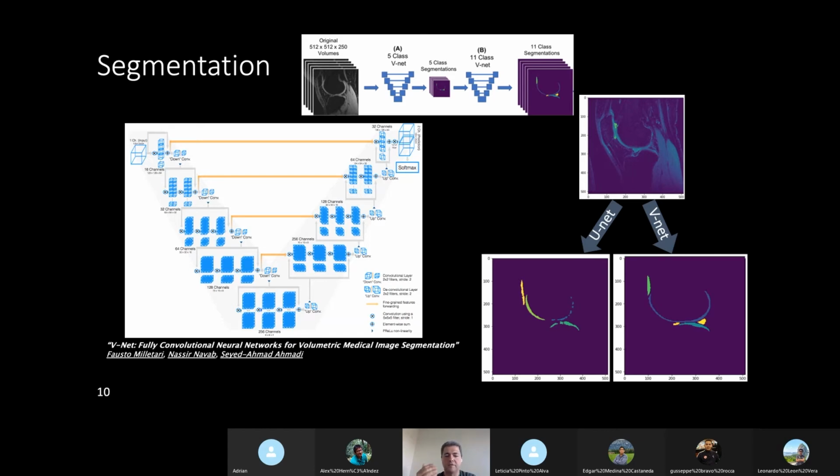The network would have a lot of trouble distinguishing lateral from medial, especially because we use flipping as an augmentation technique, since we wanted to be agnostic to laterality. So we were having a lot of trouble, especially with the laterality. On the lateral femur cartilage, for example, the network would label a lot of pixels as lateral, and lots of pixels as medial. So the quality was not great. The distinguishing of the classes was not great.